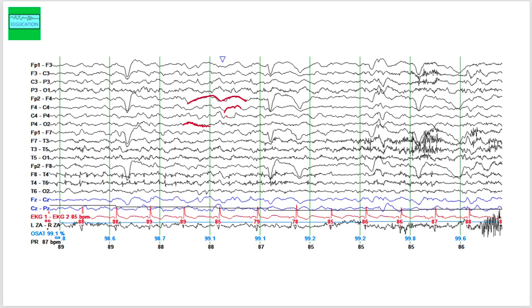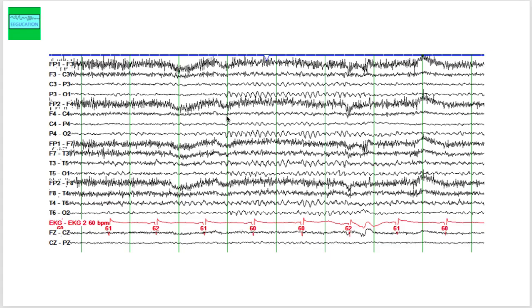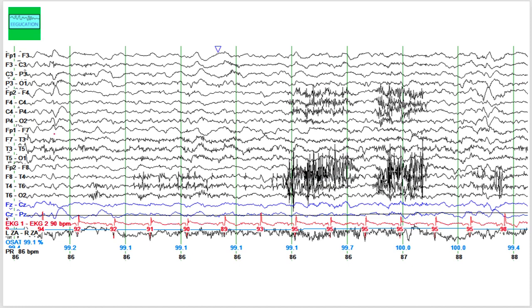On this particular page, you see a mixture of delta and theta frequencies, and this is in the awake state — making this an abnormal EEG. Comparing with the normal EEG, you can see the nice alpha rhythm in the posterior head region, best seen at P3O1 and P4O2. Going back to our patient, there is more delta frequency, some muscle artifact, and a sharp wave in the right frontal head region. You can see ongoing delta frequency, some theta activity throughout this recording.